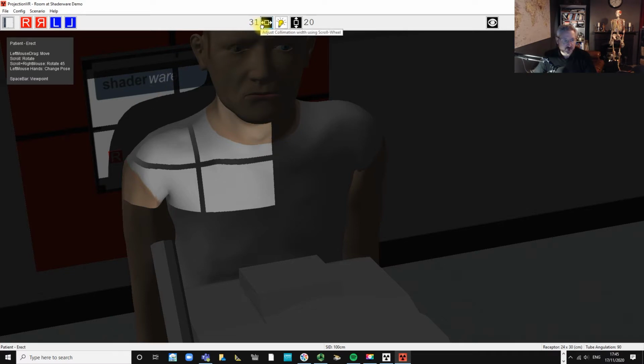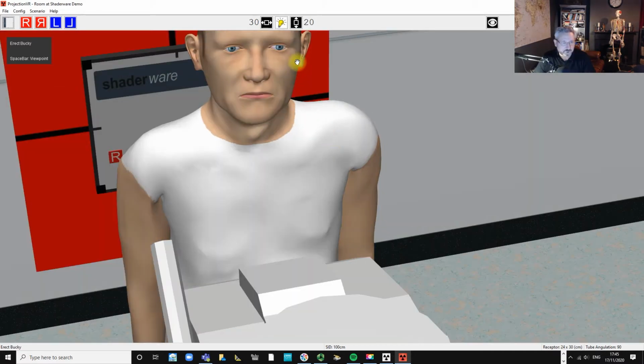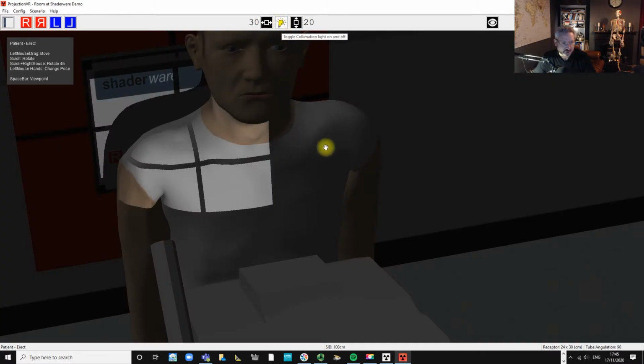I'm fairly sure, because I can see that I'm centering in the midline here, and I can see that my collimation is on this side within the collimation of the receptor, that it will be within the collimation of the receptor on this side. This is the importance of this middle check here. So now I'm fairly confident that because I've got the point of the shoulder on and I've got the sternoclavicular joint on there, I can just bring it in a little bit more, but I'm fairly confident I've got the entire clavicle on there.